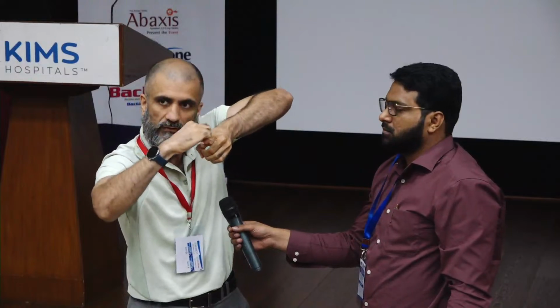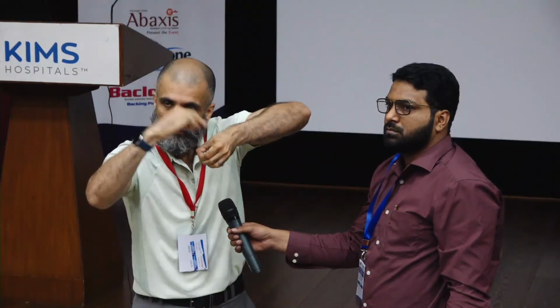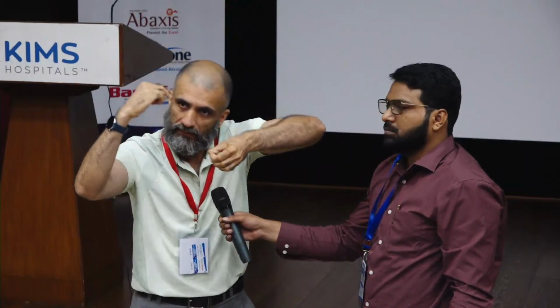You will get a semi-crescent kind of an image. So for example, this is the foramen, right? When I try to observe it, it will be like a semi-crescent. So you just need to target this part. So you will hit it, and once you walk around it, you will get a feeling as if you are falling into a ditch. And then you need to confirm it in the lateral position.